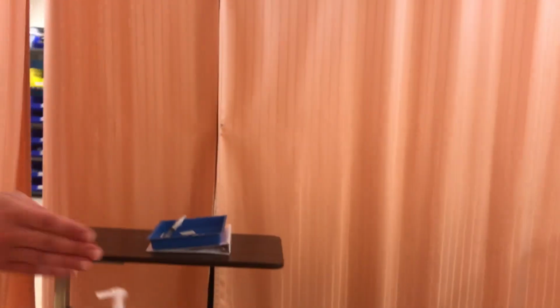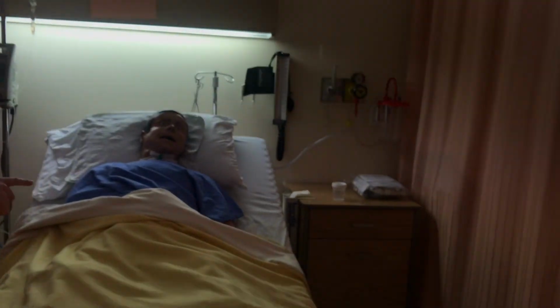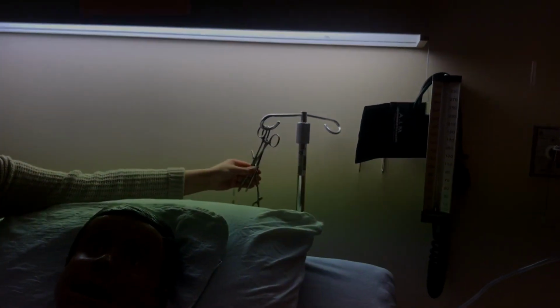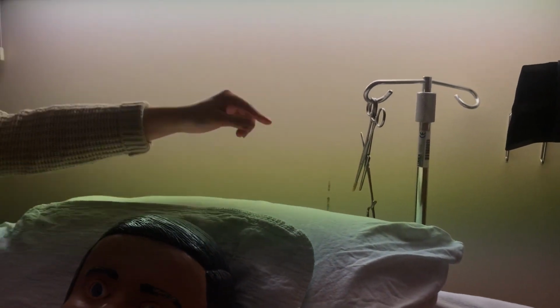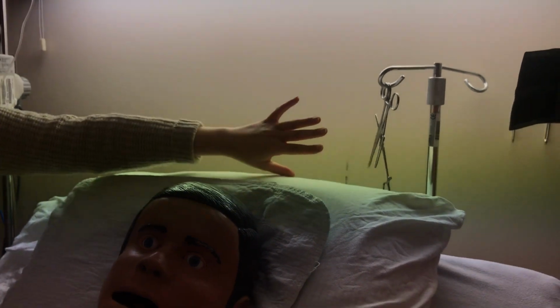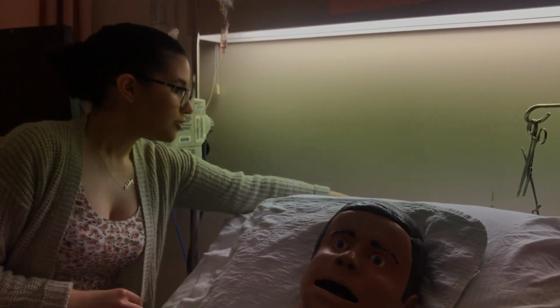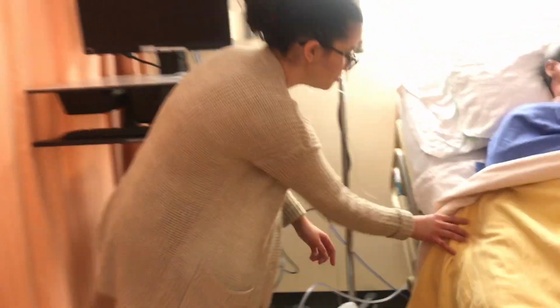And as you can see on the nightstand there is some normal saline, as well as we do have the other safety measure of clamping forceps. So again, that is for if the chest tube accidentally comes out, we can put that within the normal saline. So I'm tracing the suction tubing, and I'll get you to come this way to see the collection system.